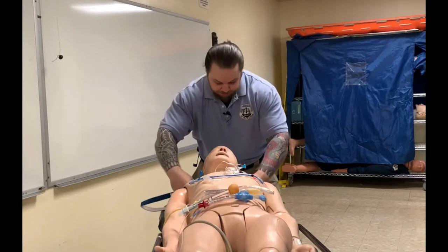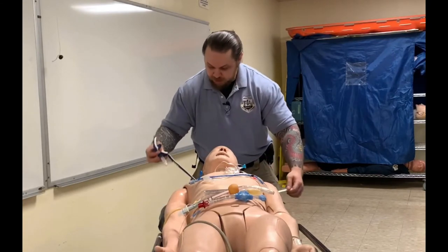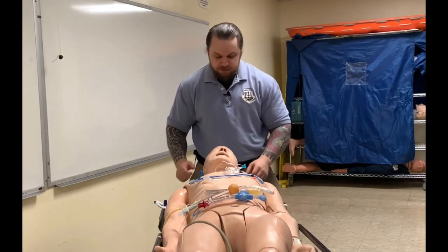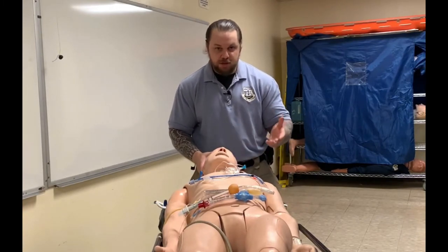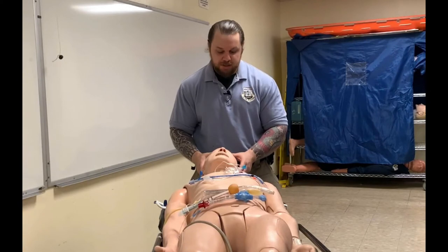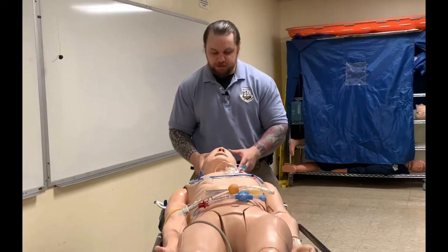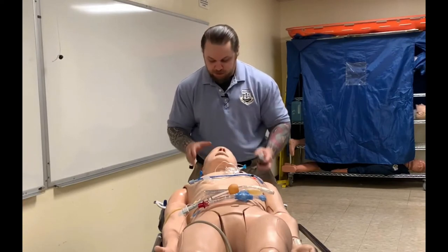Let me show you how to secure it. First, I'll place the device under the patient's head, right under the neck, so I have access to it. The slider clamp is on this side. We'll assume we've already pre-oxygenated the patient, placed them on the monitor, observed their SpO2 and end-tidal CO2, and are now ready for the procedure.